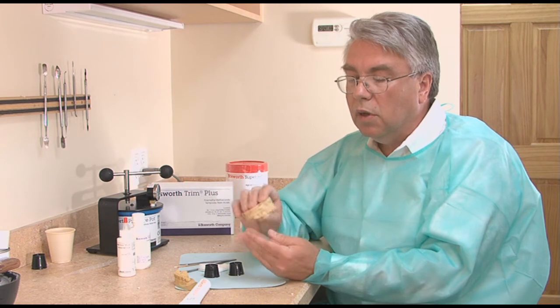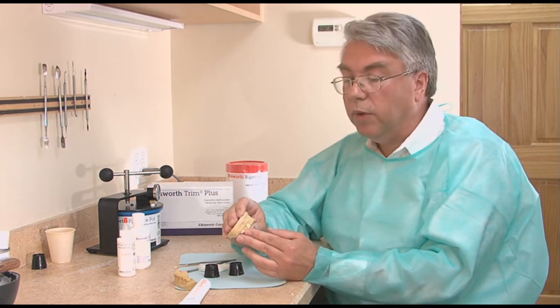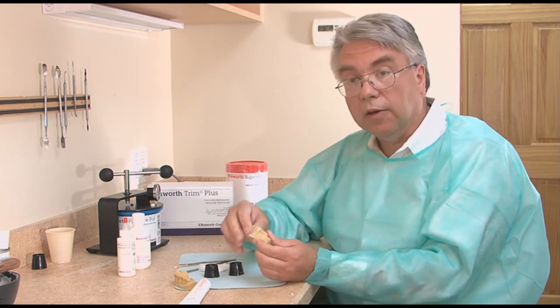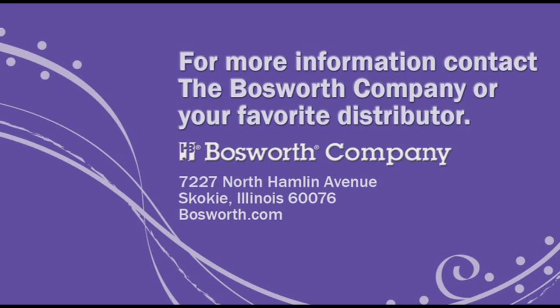The patient now leaves with hopefully a shade and shape that will match what they came in with — it will probably look even better. This presentation demonstrated Trim Plus PMMA temporary crown and bridge material. The same technique may be used with Trim PEMA temporary crown and bridge material. For more information, contact the Bosworth Company or your favorite distributor.